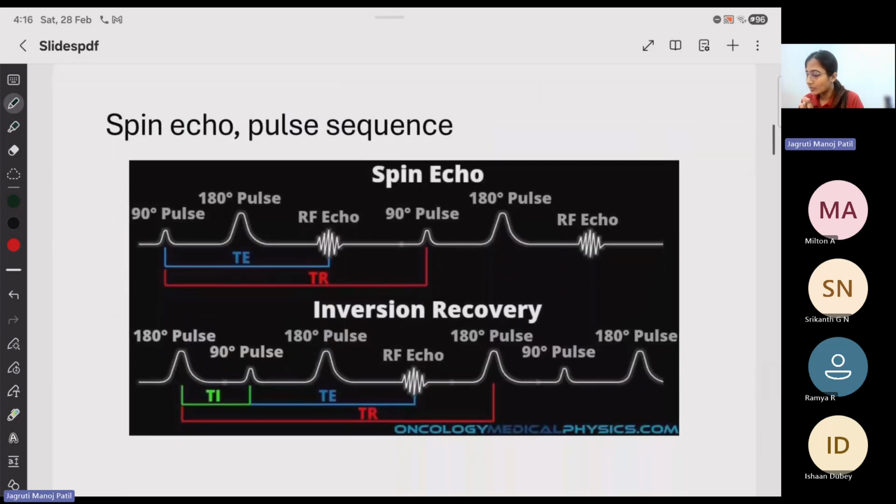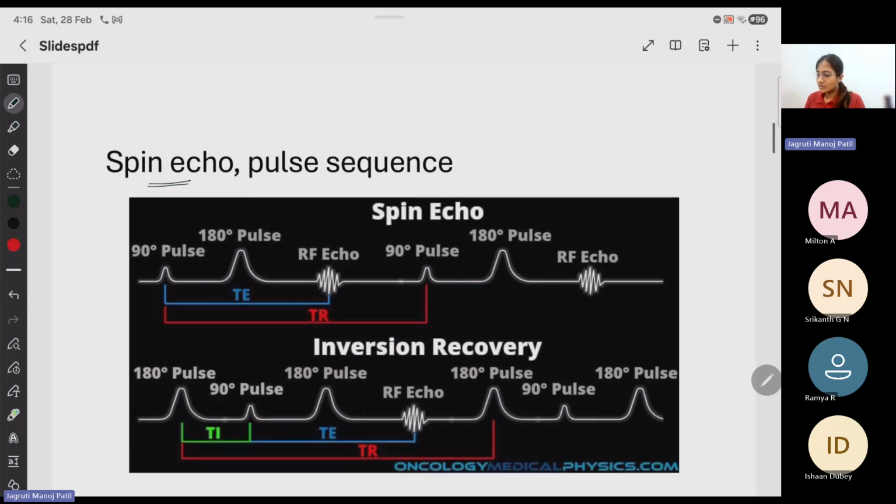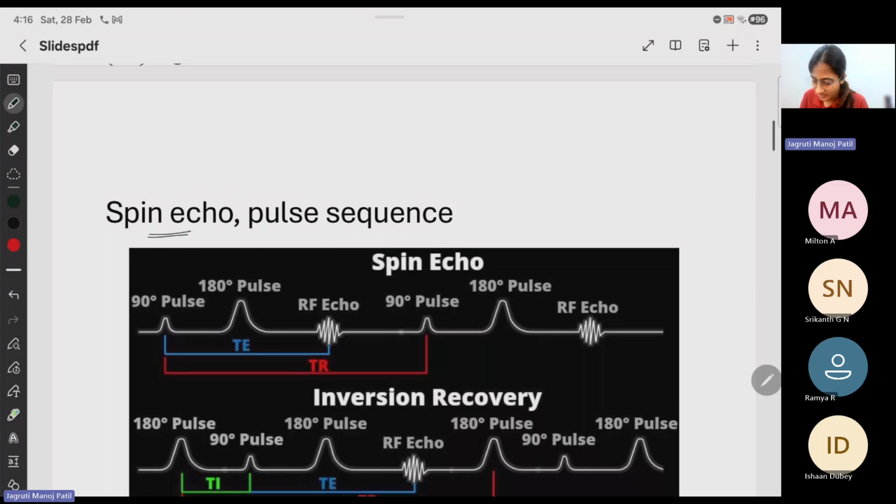Now, this was a point where we were confused about why T1 and T2 weighted images look different, and what the reason behind that was. We looked at one being spin-lattice and another being spin-spin. One took less time, one took more time, but why did the time give us higher and lower energy differences when looking at different tissue organs? The basic principle behind it lies in the spin echo sequence. I'll give you a basic idea about the axes, where you should focus.